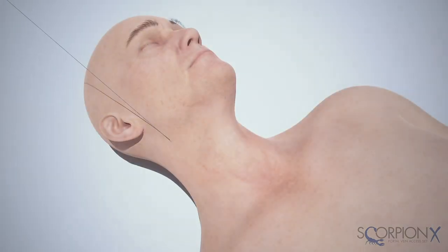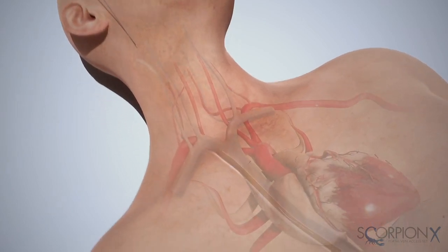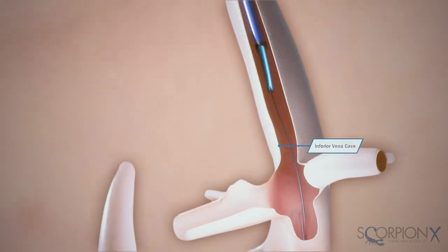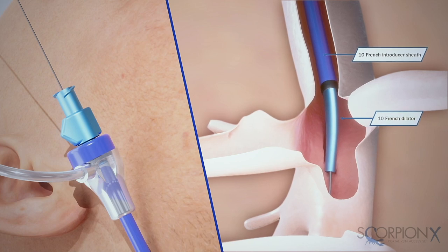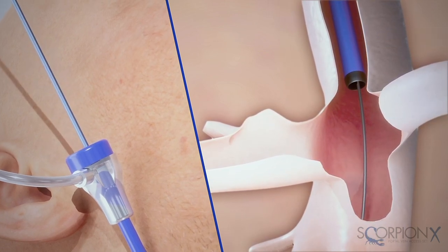After introducing guide wire access to the inferior vena cava, place the 10 French dilator and 10 French introducer sheath assembly over the wire to the ostium of the hepatic vein. Remove the 10 French dilator and, over the guide wire through the 10 French introducer sheath, insert the 5 French MPA catheter.